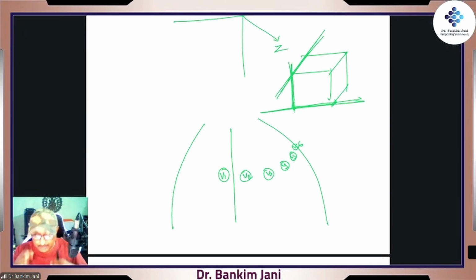So you are watching, and these are all positive. That means you are watching from the front, as if you are taking a camera and taking the heart all the way. So you are watching the surfaces.